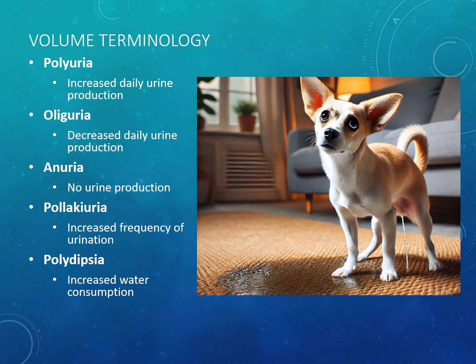When there's a lot of urine, it's usually pale or light urine, light yellow urine colored with a low specific gravity, usually because it is diluted. This can be associated with nephritis, diabetes mellitus and insipidus, pyometra, and liver disease. It can also be associated with the administration of certain drugs that cause more urination, like diuretics, like Lasix, for example, or steroids, or even IV fluid administration.